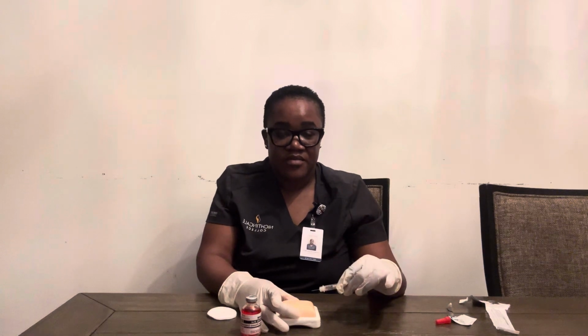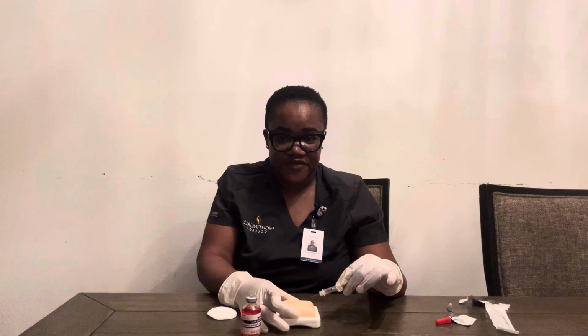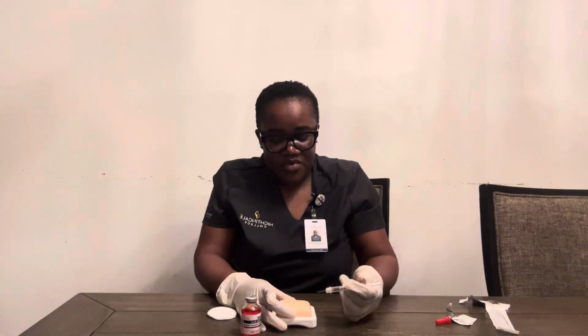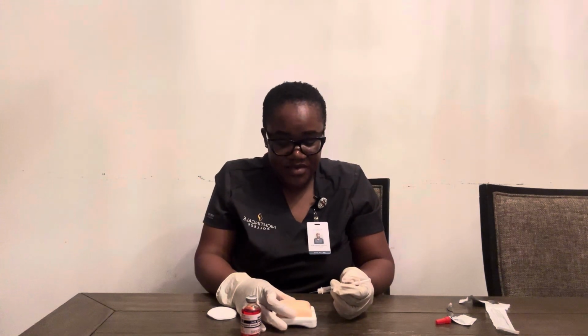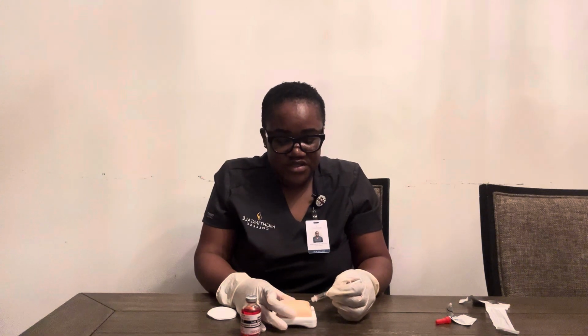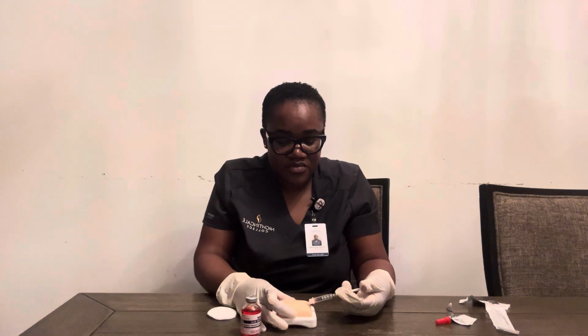All right, so now I'm gonna go ahead and inject my medication at a 5 to 15 degree angle, and I'm only gonna go about 3 millimeters under the skin. And I should see a bulge when I do this. And I'm gonna inject the medication nice and slow.